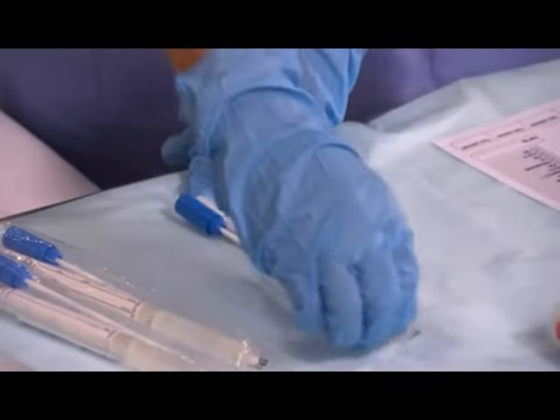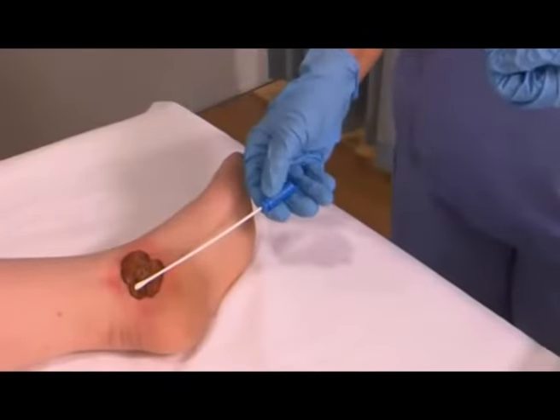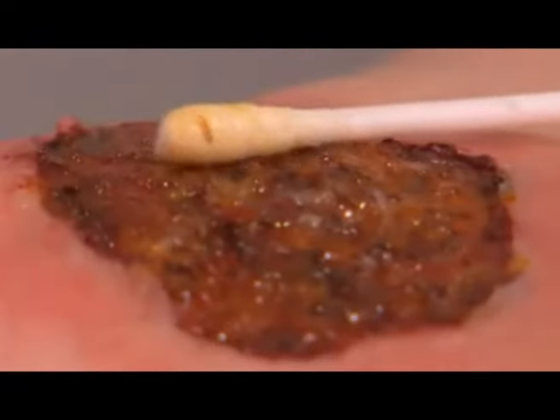Open the sterile swab packet. Gently place the swab over the wound and rotate the swab while moving over the wound. Ensure it is well covered in exudates.